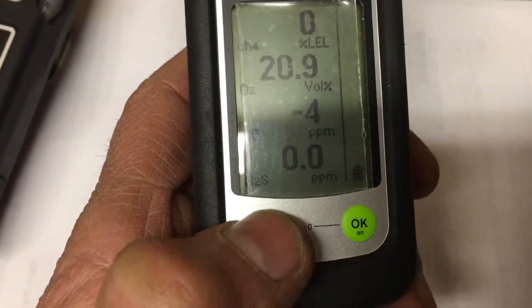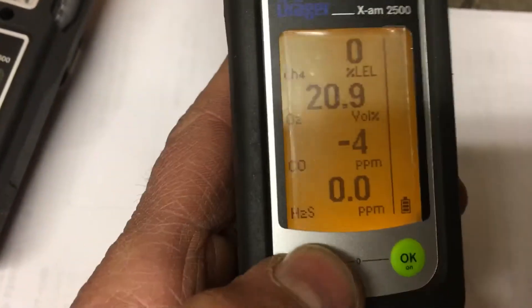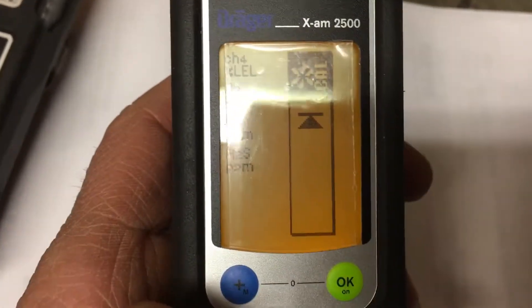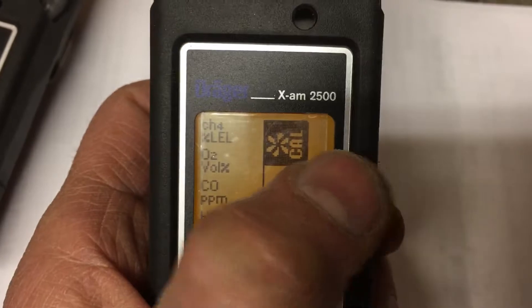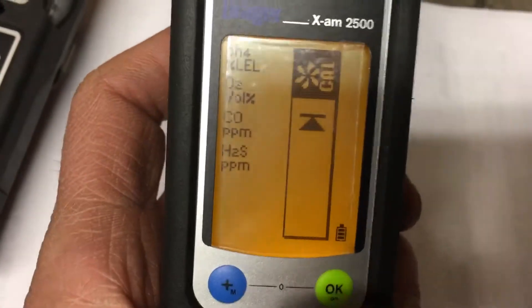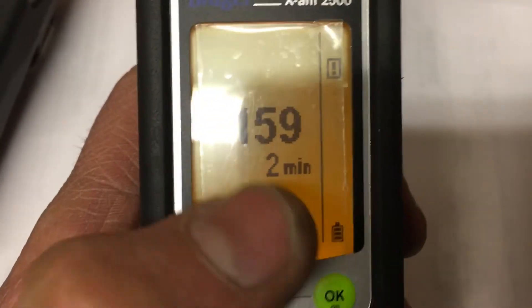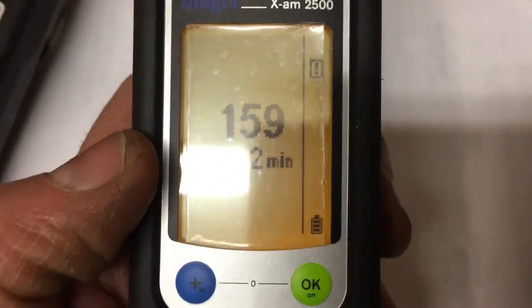To do a fresh air cal, push the blue button three times — one, two, three — and you get the fresh air cal fan icon. Then push the green button once. Since the device is cold, I get two minutes remaining before I can actually perform the fresh air cal.